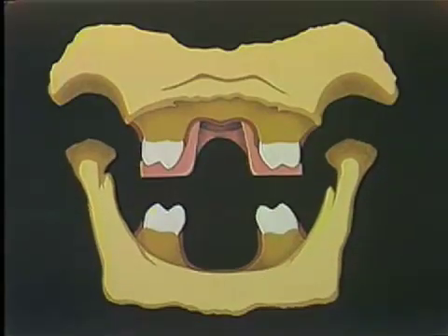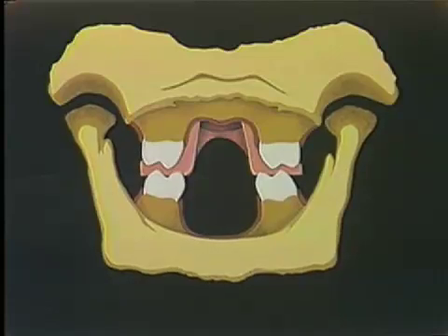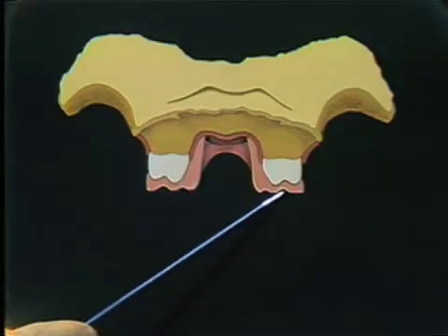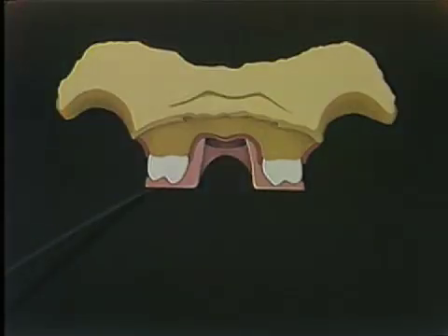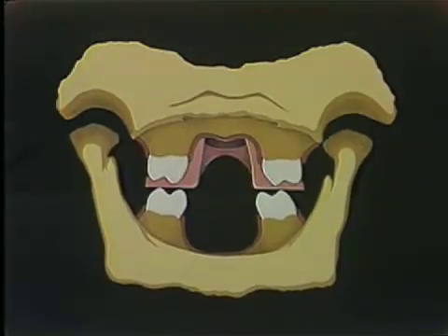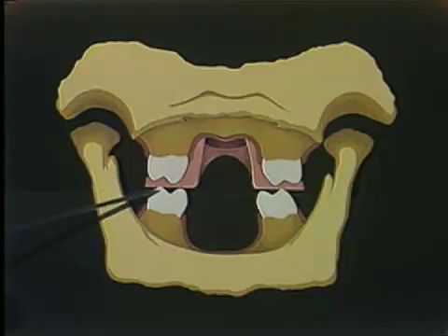We have to establish even contact. We do this by bringing up the mandible and tapping gently to get even indentations. Notice the indentations. Next, we have to remove these indentations to get a flat plane with just supporting tooth contact. Now we have a flat occlusal plane with no interlocking of the cusps, which illustrates the even contact in the supporting cusp area.